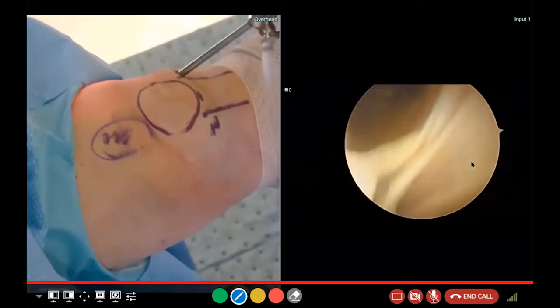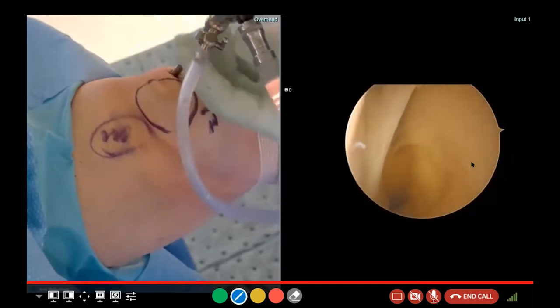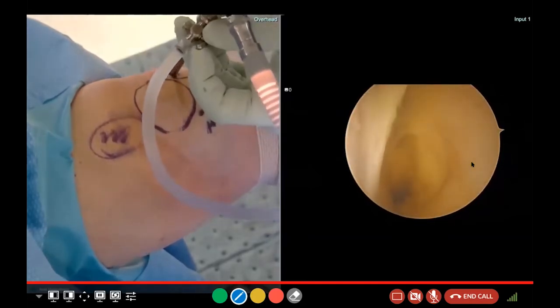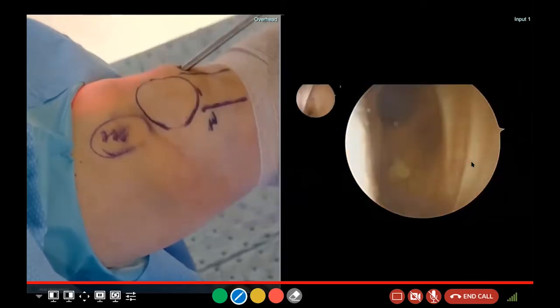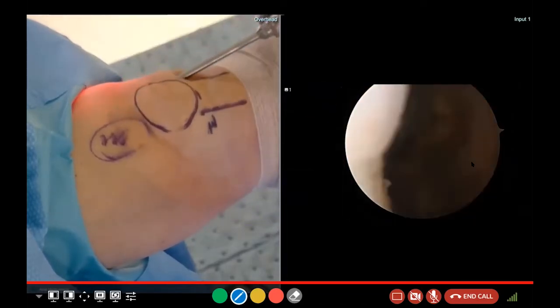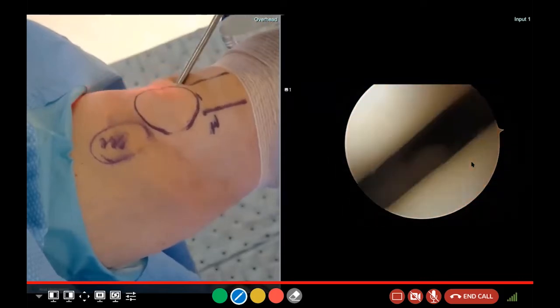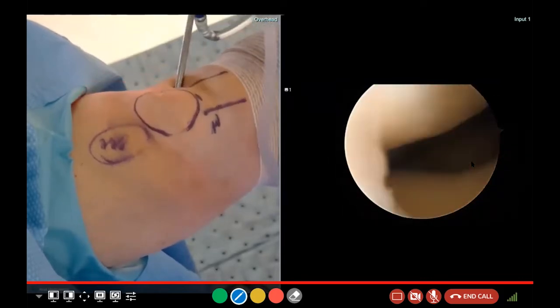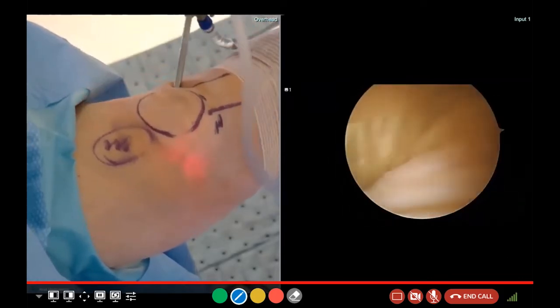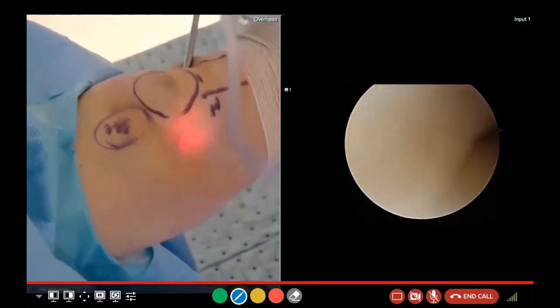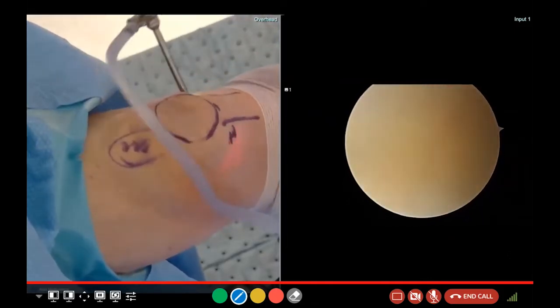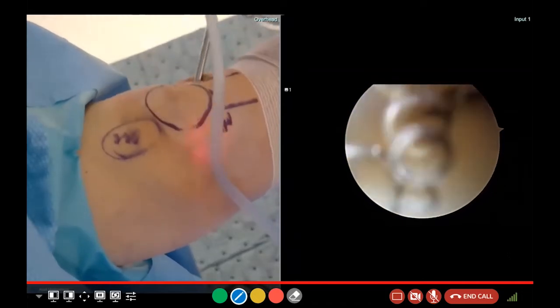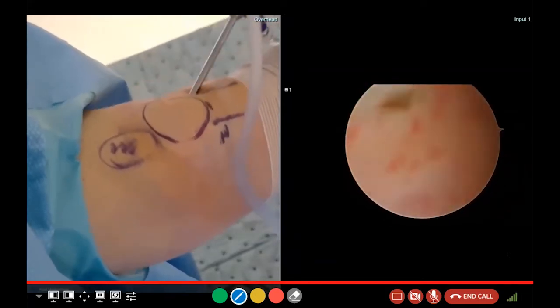This is what we call the lateral gutter. You want to make sure nothing is loose and sitting over here in the pocket. I don't see anything of consequence. That's just me flushing out the synovial fluid. There's a little bit of debris here, but most of that is stuck to his capsule, so we don't want to remove or tear that out.